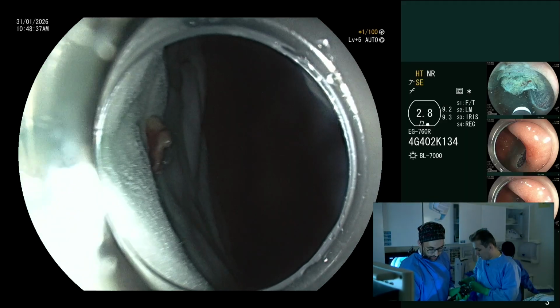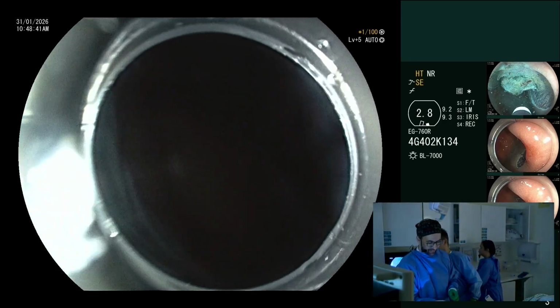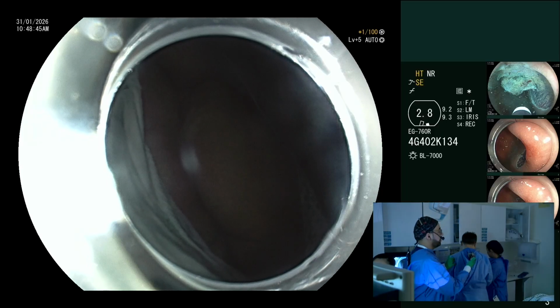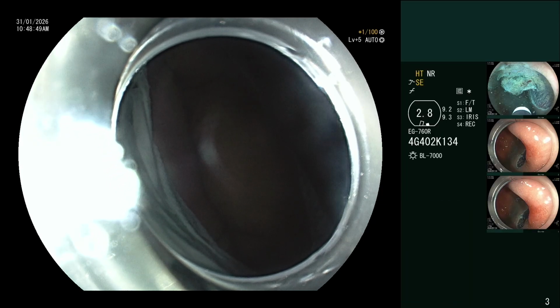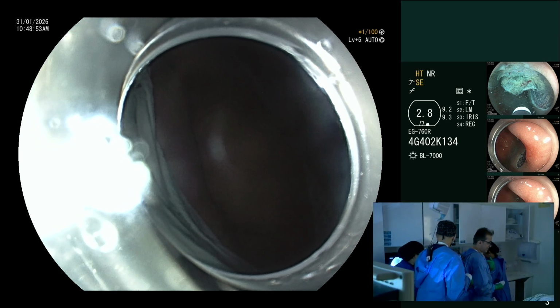Well done. Let me see. Cancer. Can you give me the specimen? Can we get back to the floor room? And he will do it. I didn't do it. I did half the incision. He did half the incision and he did the dissection. He took the last piece. I am his student. That's what I always say.